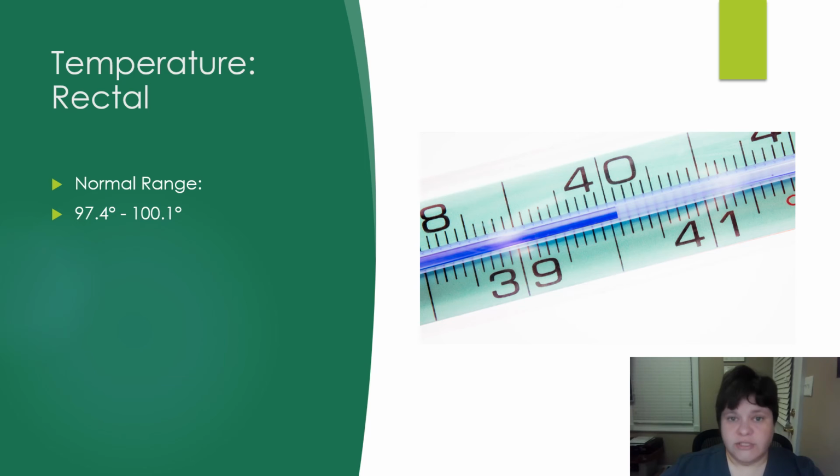Now, there are other ways you can take your temperature as well, and that includes axillary, which is under the arm. You can take it with sensors that read up here by the temporal pulse, and there are also ones that you can take in the ears. But oral and rectal are the most common types.